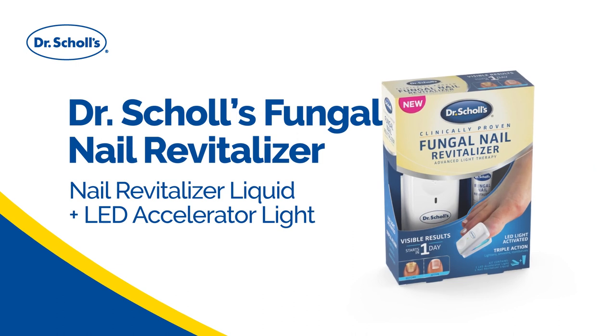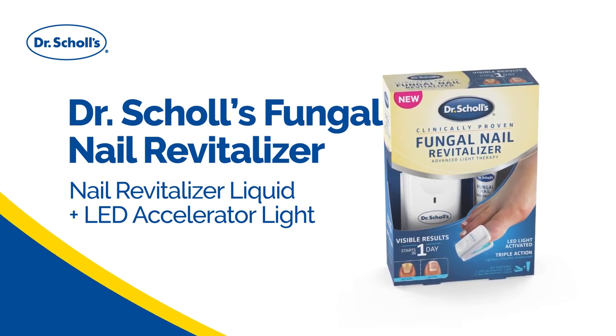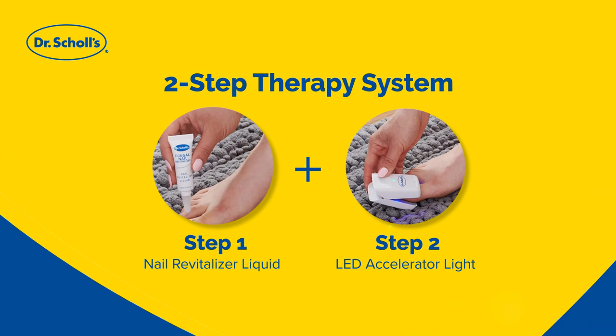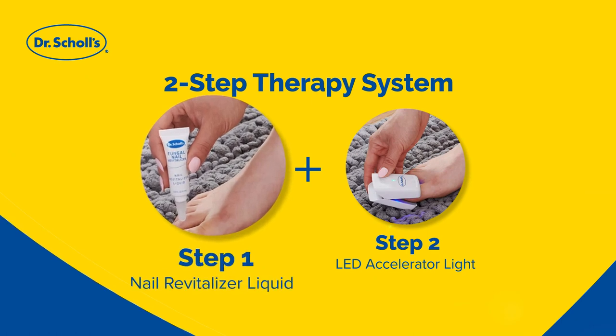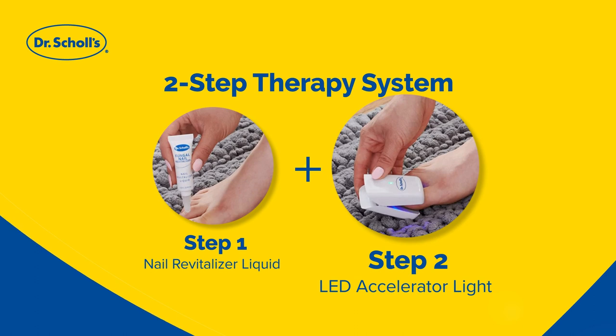The Dr. Scholl's Fungal Nail Revitalizer Light Activated Therapy Kit is a two-part system to help lighten toenail discoloration due to fungal nail infection. The kit contains a proprietary liquid that is applied to the affected nail with a specialized LED accelerator light that helps activate the formula.